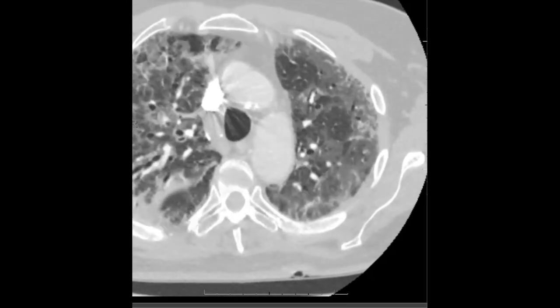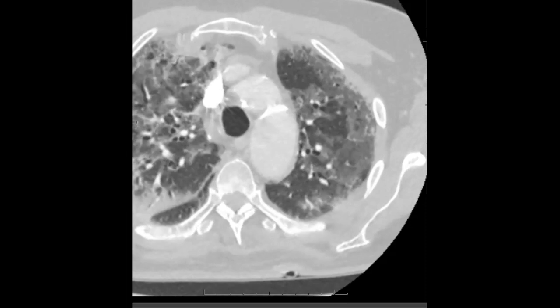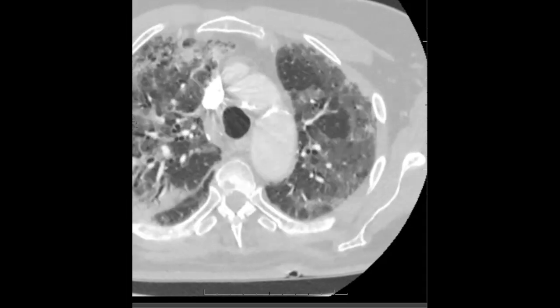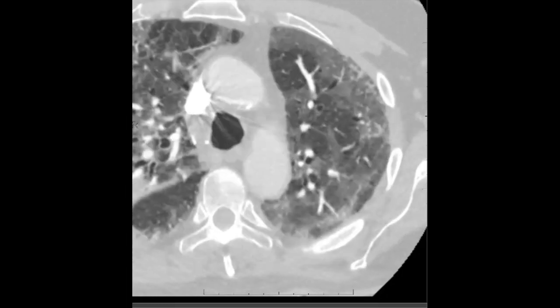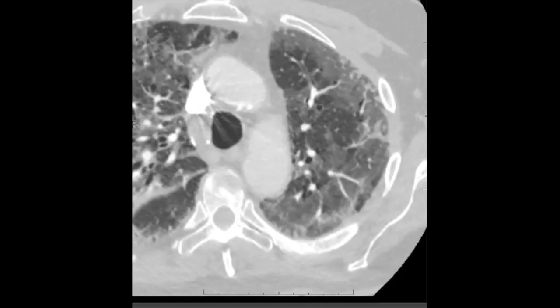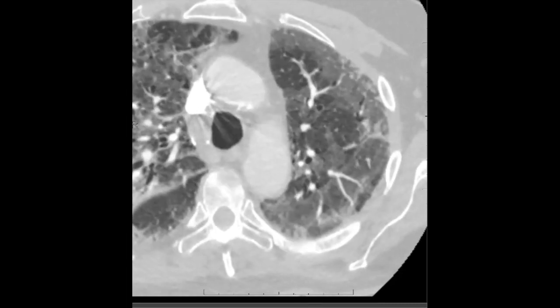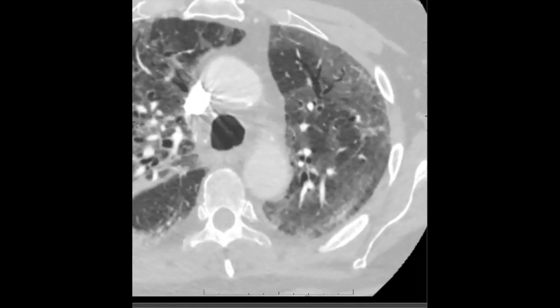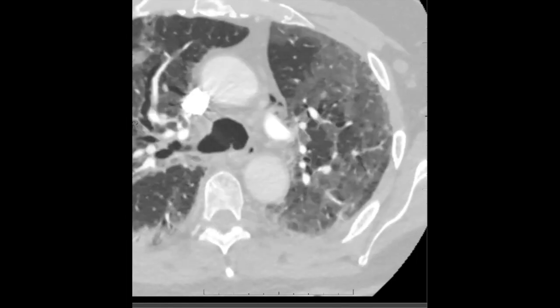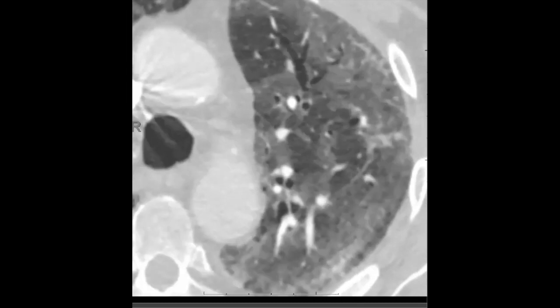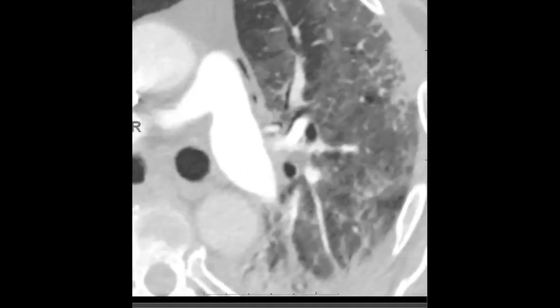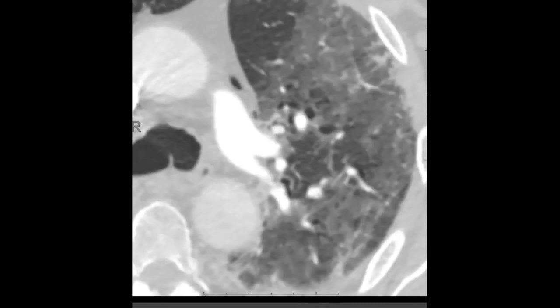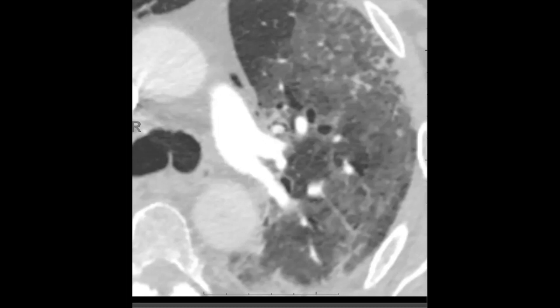If you look very carefully along some of these left upper lobe vessels, you'll see there are too many lucencies — little lucencies that don't look like airways. Every pulmonary artery has an associated bronchus. Here's a pulmonary arterial branch in the left upper lobe, and there's the associated bronchus. But adjacent to the pulmonary artery, there are these tiny little lucencies that don't go into airways. That lucency, if we follow it back, really doesn't go into an airway — it's on the wrong side of that pulmonary artery. So that's an example of pulmonary interstitial emphysema, this gas tracking along the pulmonary artery back into the mediastinum, causing pneumomediastinum from alveolar rupture.